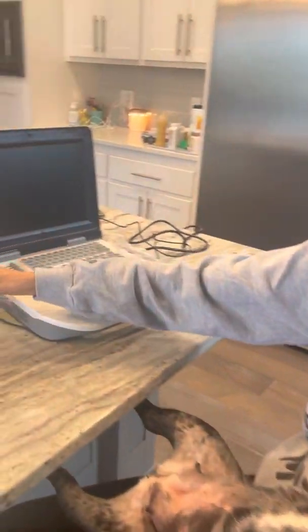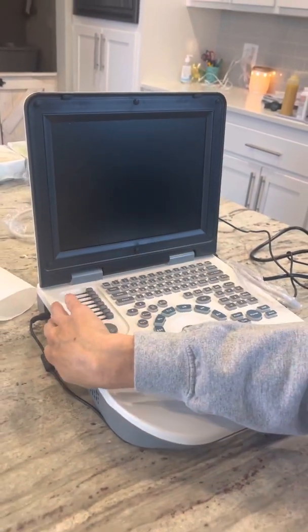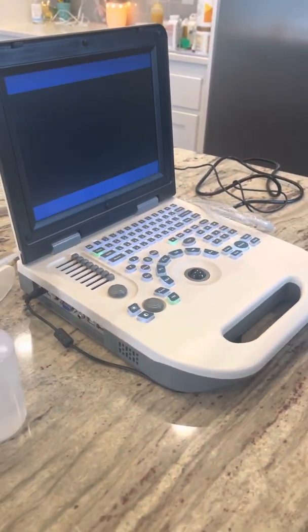This is our at-home ultrasound machine. We got it off of Amazon for a couple thousand dollars. It is really handy to have this at your house, especially if you're doing a lot of ultrasounds.